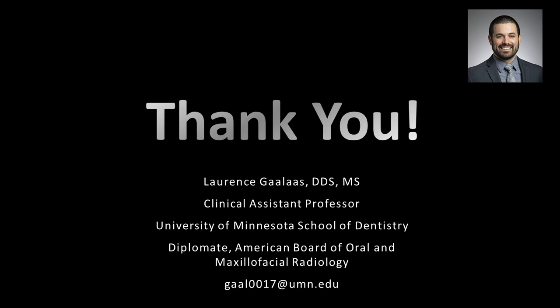Once you get to a certain lower limit of age, speaking from the experience of my 2-year-old and 4-year-old this afternoon, the kids just can't sit still that long. What we've done in the past is if we have a young kiddo who really needs 3D imaging, we'll order a medical CT, which goes quite quickly. It's just a second or less for that jaw and head and neck anatomy. In that setting, you actually have the option of sedation too. So if a patient really can't stay still because they're really young and you must have that 3D information, the medical CT might be the way to go.